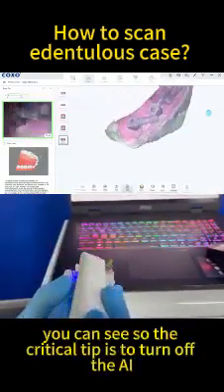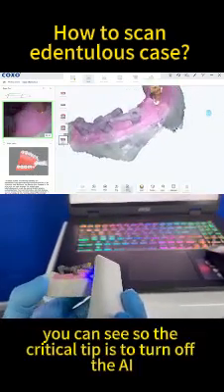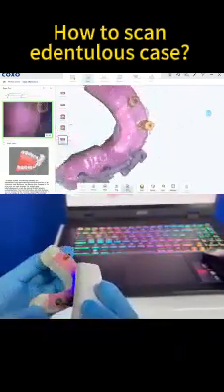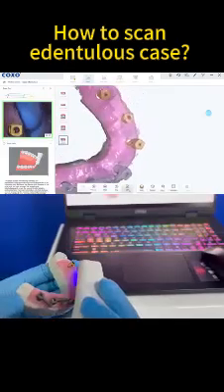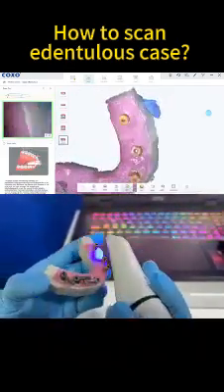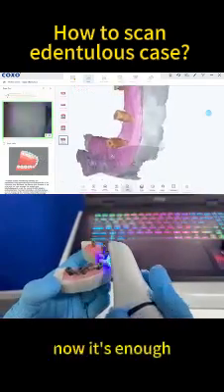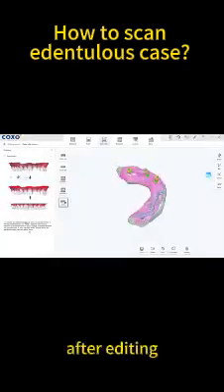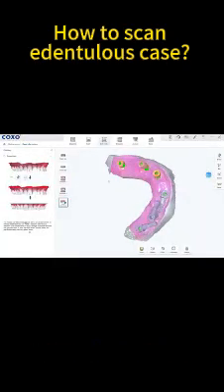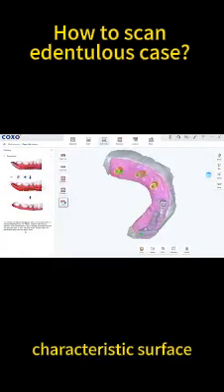The critical tip is to turn off the AI and start from the soft tissue. Now it's enough. After editing, you can check the data of the scan body, especially for the characteristic surface.